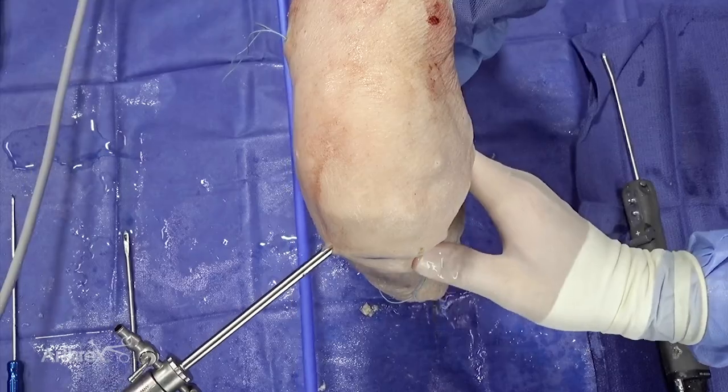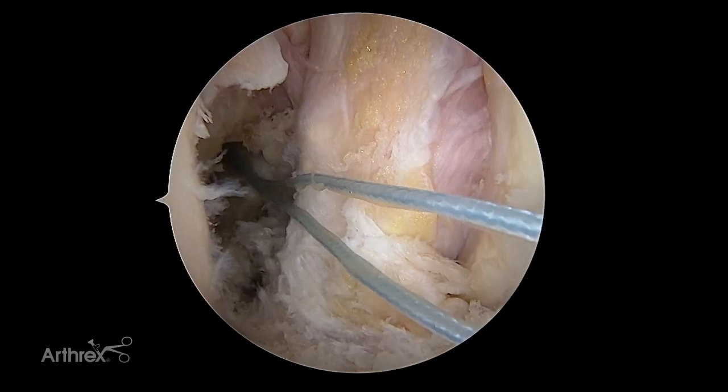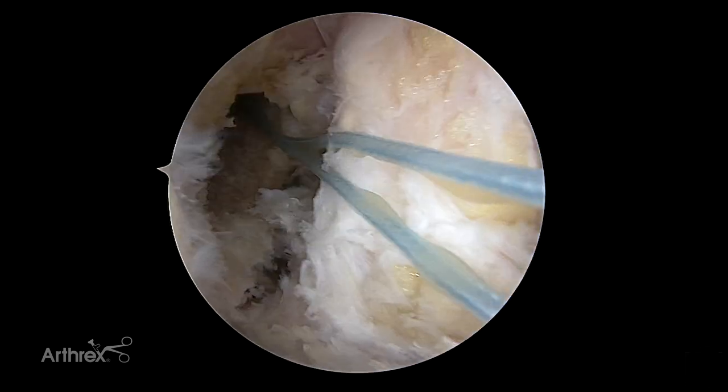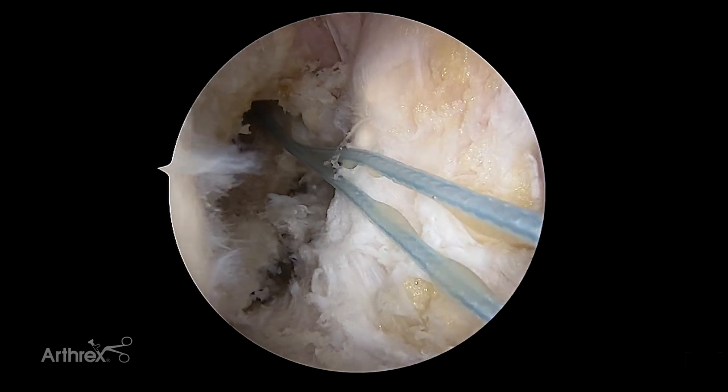This is a right knee joint. We've already prepared, for sake of time, our anatomic tunnels. You can see our anatomic femoral tunnel and our standard tibial tunnel that's been centered appropriately.